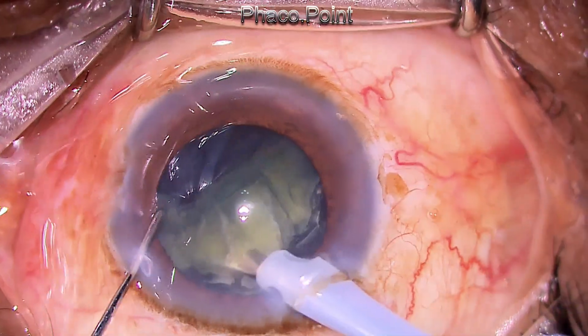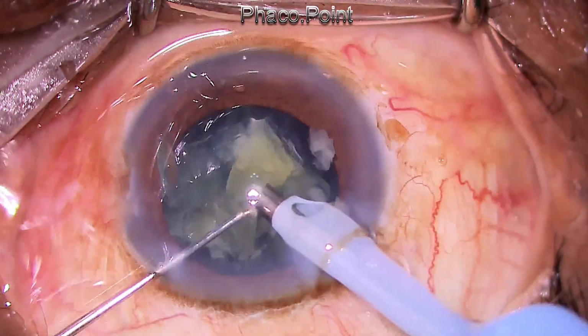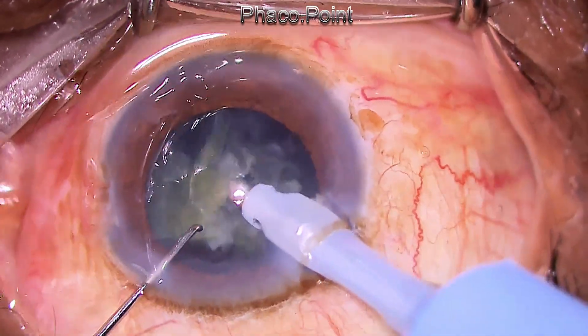and you can end up getting much clearer corneas. So try to make this slight adaptation if you're using a standard 30-degree tip held in the bevel up mode, and you will see amazing results in your post-op cases.